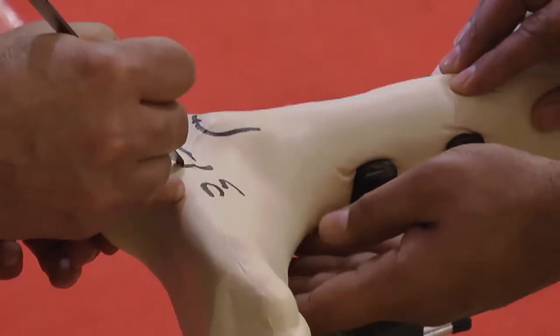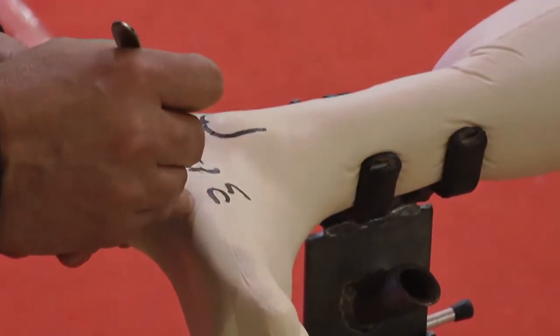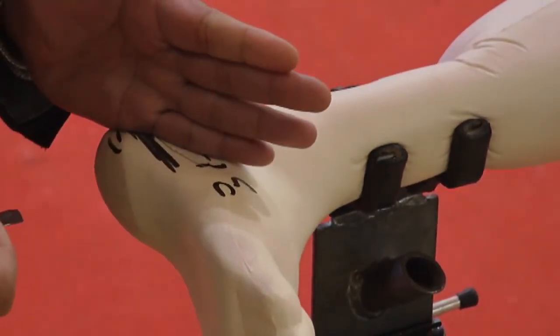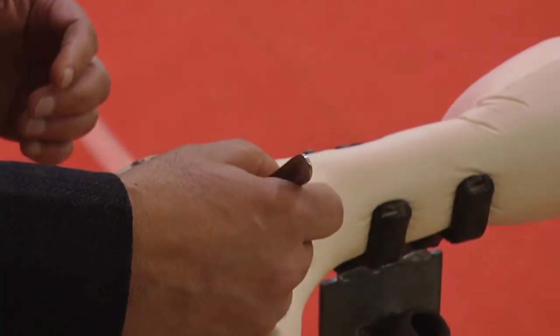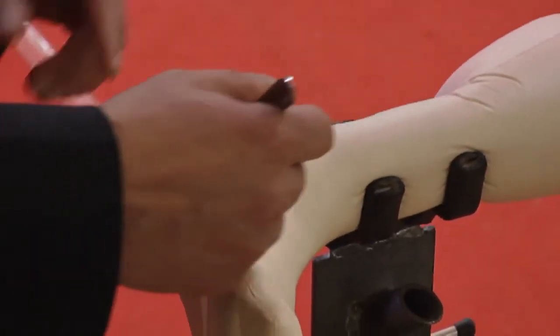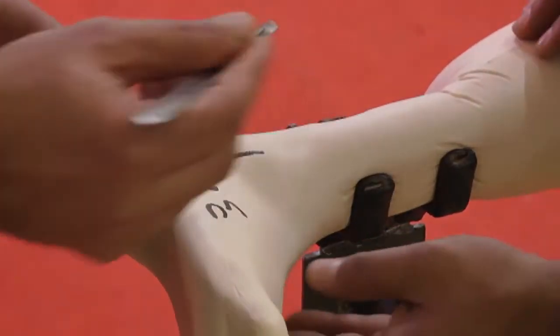Here, if you go onto the dorsal skin, it's all right, because here the circulation is not that much of a problem. Because your calcaneus is inclined at an angle, there's a calcaneal inclination angle, and if you continue along the junction of the dorsal and the plantar skin in this area, you will end up going plantar to the calcaneocuboid joint. So your anterior end of the incision can err a bit towards the dorsal skin side.